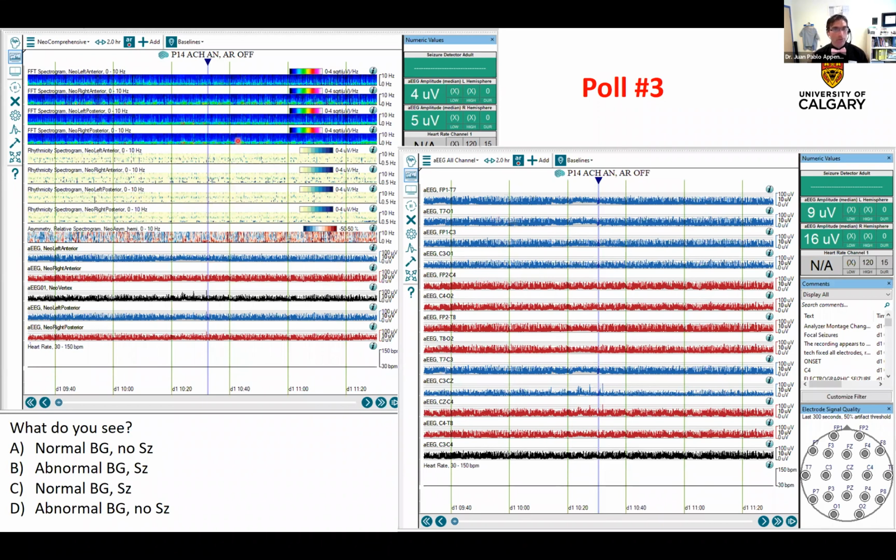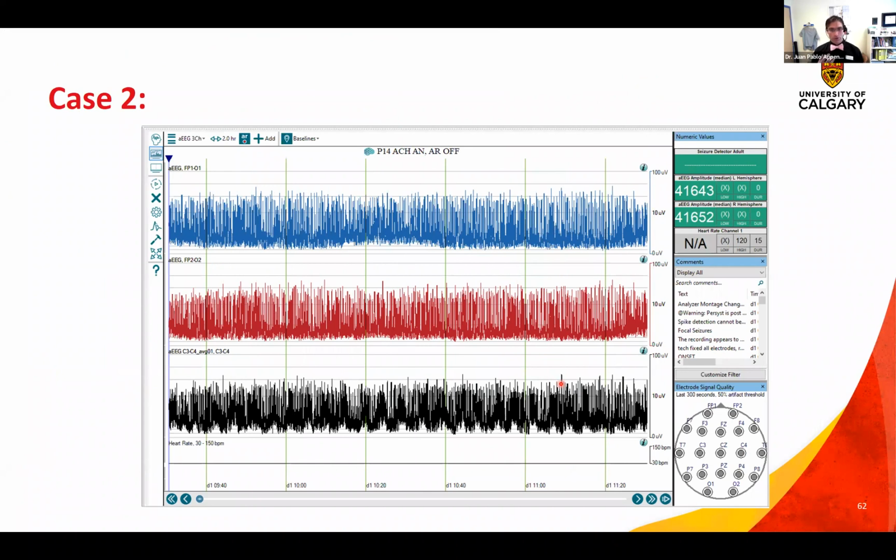So we're going to briefly discuss this, but this background activity for a newborn is quite suppressed. You can see here in the Amplitude Integrated EEG, it's a very suppressed and maybe even discontinuous background activity. It's not the nicely formed awake and sleep. However, these look like awake and sleep, and that's why probably people answered more normal. But guess what? Can we close the poll? I think if I would have shown you these, you probably would have guessed a little bit better.